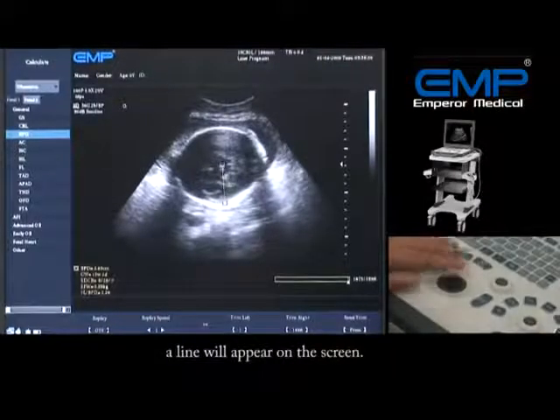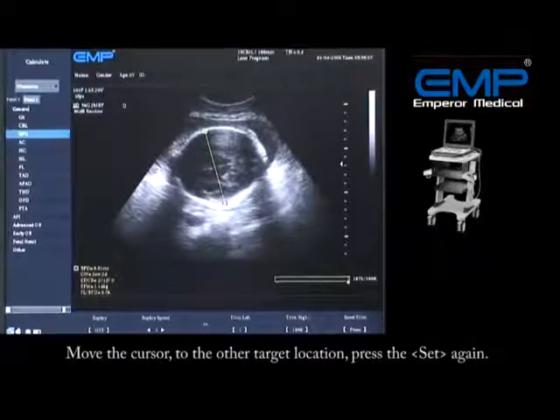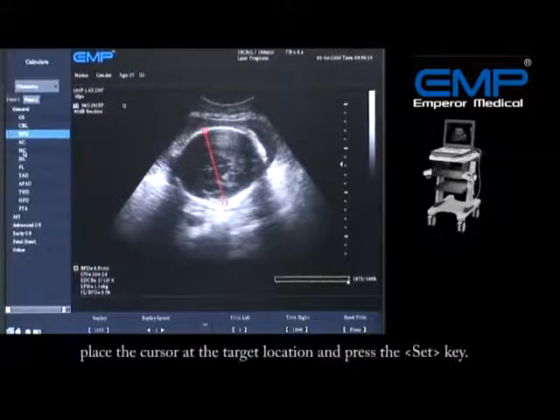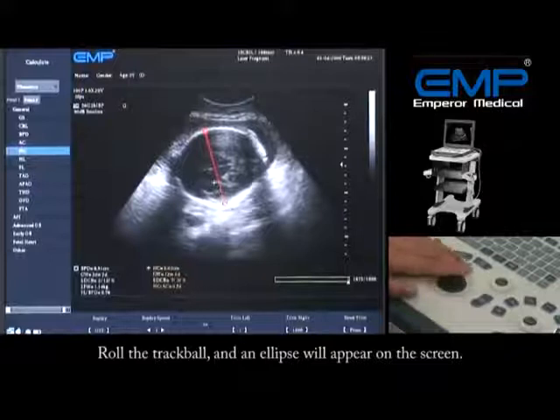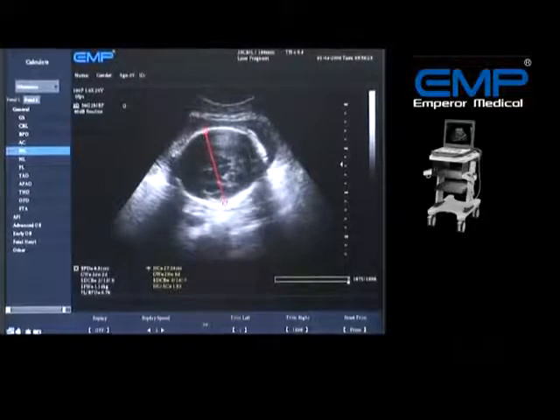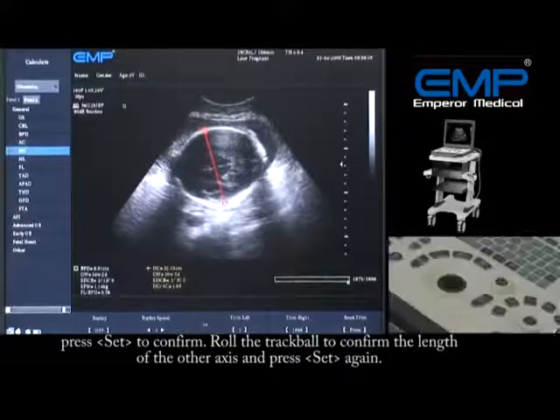A line will appear on the screen. Move the cursor to the other target location and press Set again. To perform an HC or AC measurement, place the cursor at the target location and press the Set key — this point is the starting point of the long axis. Roll the trackball and an ellipse will appear on the screen. Move the trackball to adjust its size and position, press Set to confirm, then roll the trackball to confirm the length of the other axis and press Set again.